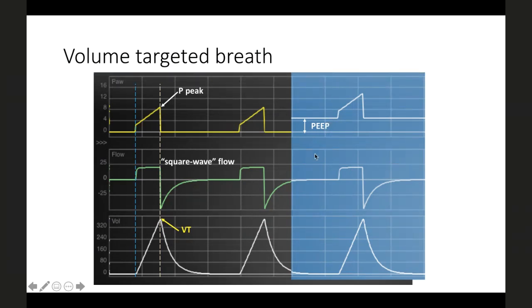Like we say new normal in COVID times, we are giving a new baseline to that system. The system is not allowed to come back to 0 after every inflation. The acinus gets inflated and comes back to PEEP. So the acinus collapsing, the risk of atelectasis, comes down.